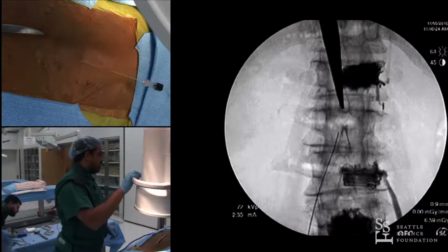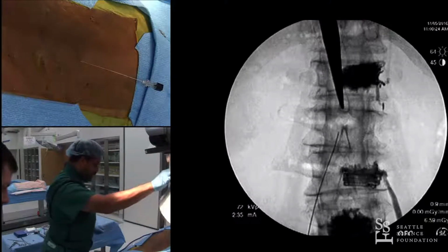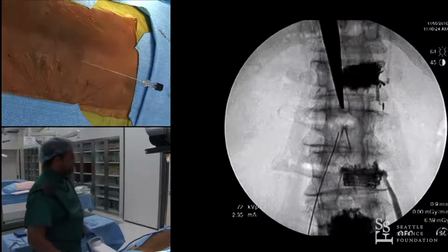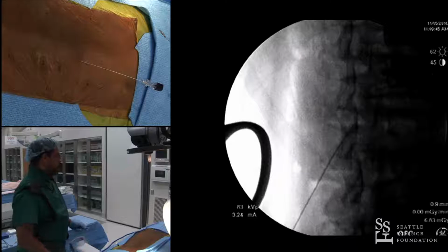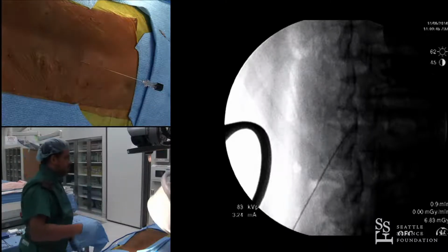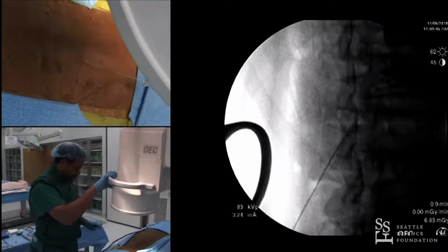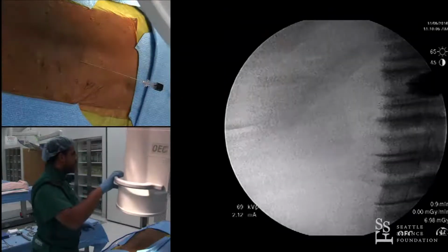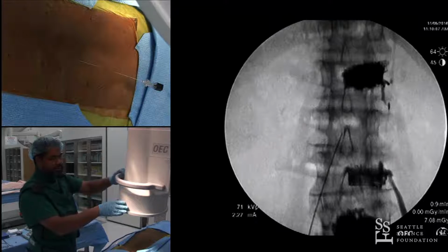We'll see once we get closer. Let's go ahead and take this to a contralateral view. And with the view, we can see the angle of the needle. You can see the lamina there where the needle is placed, and the same angle as the needle, and that would be a great trajectory for entering the epidural space. There are some osteophytes there, so we'll see if there's any real openings. Rotate degrees towards me. There you go.